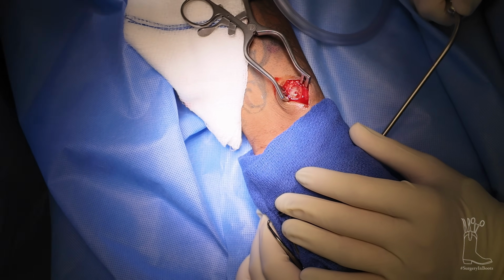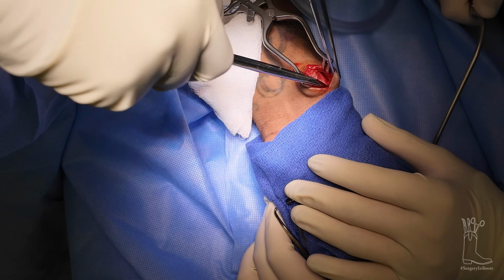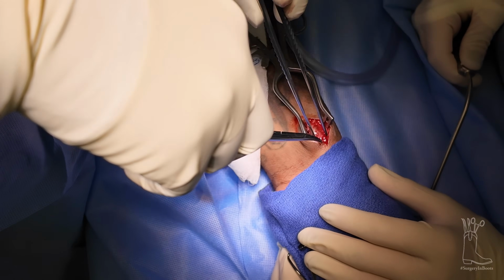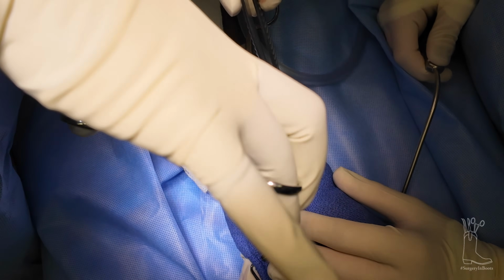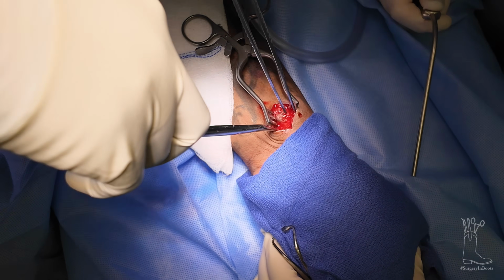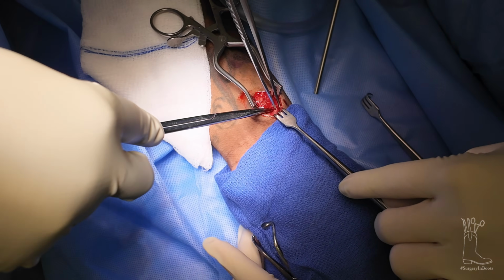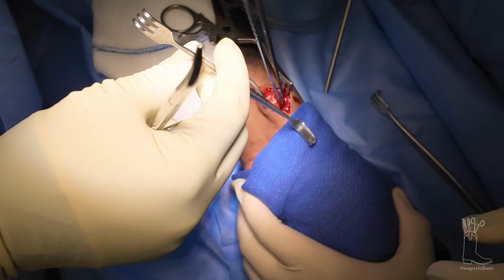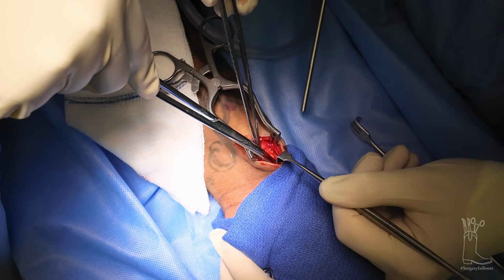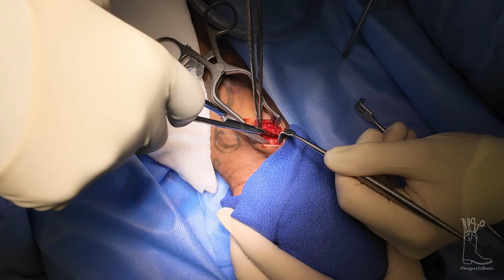So what we're going to try to do is get proximal control or distal control first. Because it's a vein, we can get proximal control. That'll save us a lot of headache. You got a little small retractor? I'll put it in there. Hold on. Don't wanna go there. Okay. There we go.